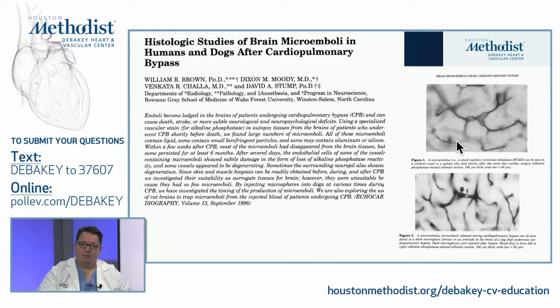And again, these are the nice air emboli in the dog capillaries while they were doing a cardiopulmonary bypass. And this is visually, you can really see how the microembolus signal dilates these capillaries, and this is how they come through.